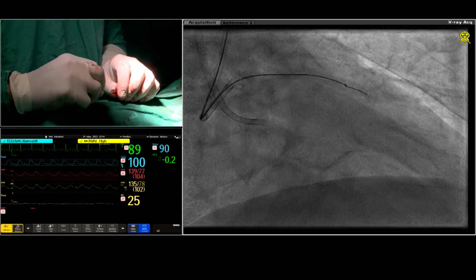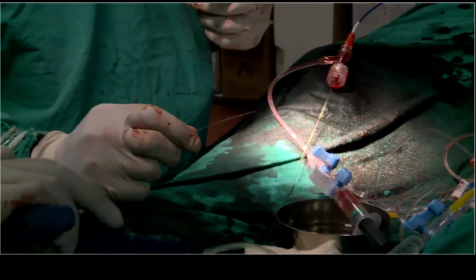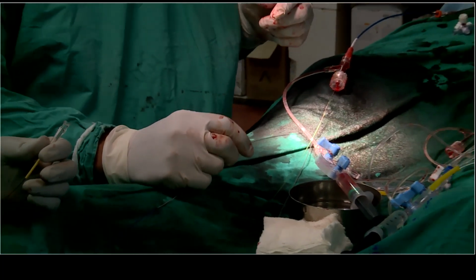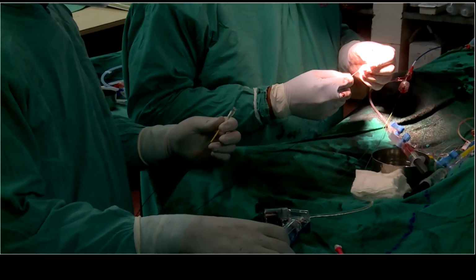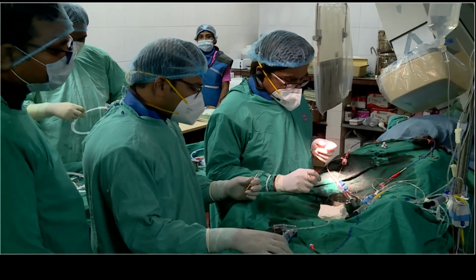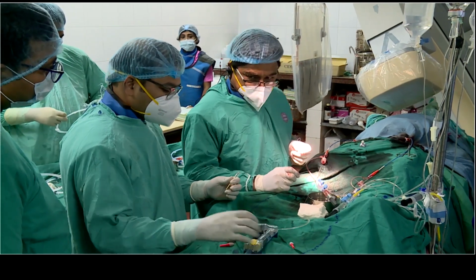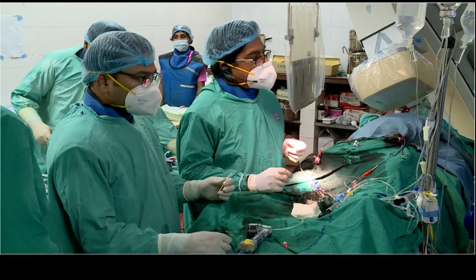Okay, what is the advantage of this Caravel over a microcatheter? The Caravel is also a microcatheter, 150, that is the only one we have, so we'll use that. Any advantage? It is actually thinner than a Corsair, the entry profile is slightly smaller than a Corsair, so crossing the micro channel would be easier. हाँ.